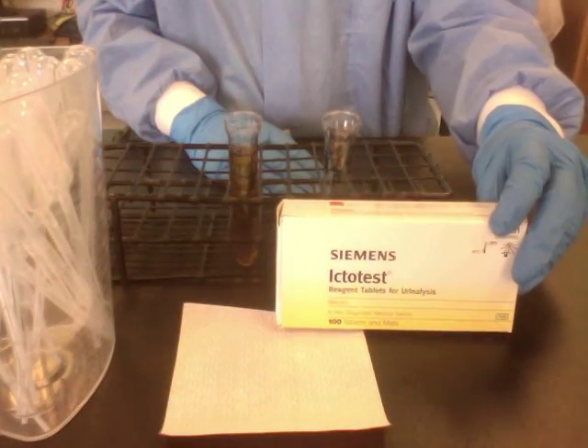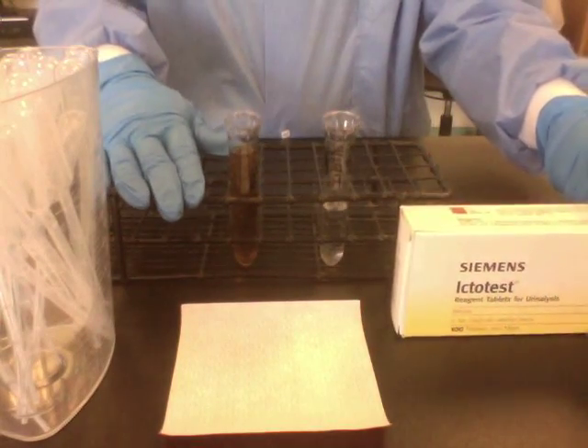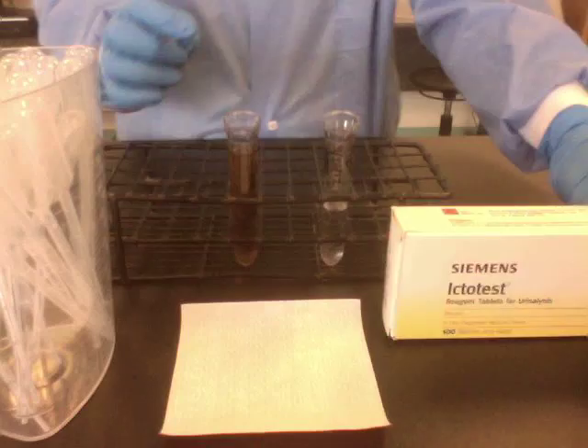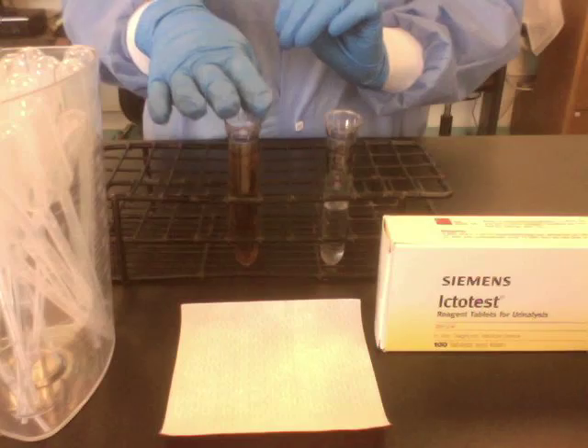The Ictotest is used for the confirmation of bilirubin in urine. To do the test, you need the kit, a specimen, and water. Here I have my labeled water and specimen.